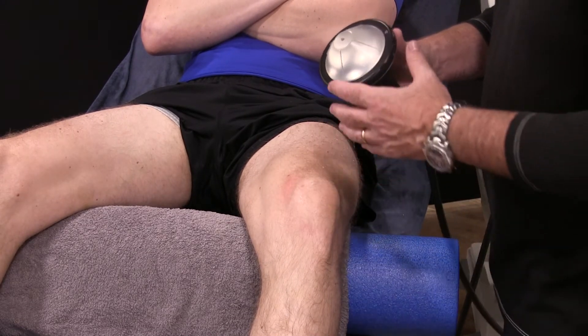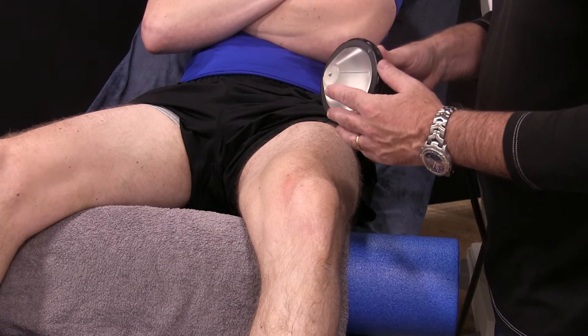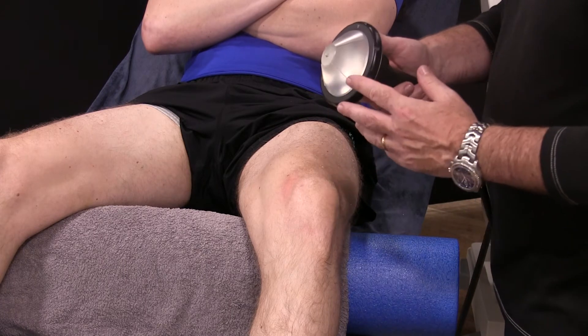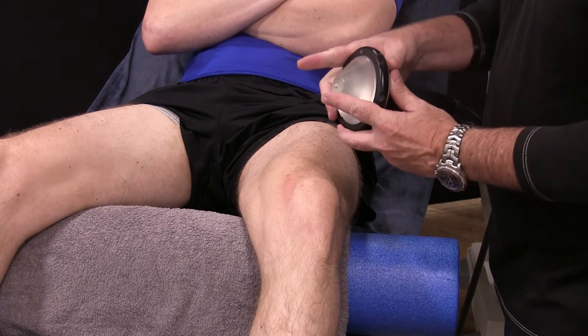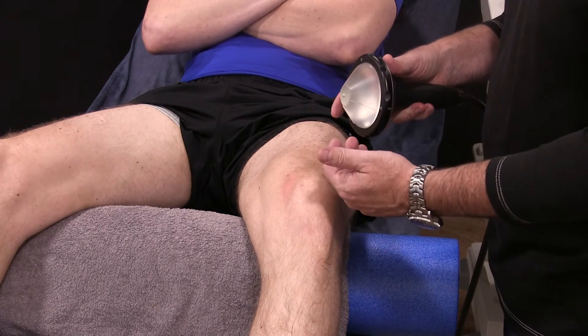We're here to talk about the Piezo Wave 2 from Elevation. The Piezo Wave is a focused shock wave — it uses an acoustic pressure wave, and those pressure waves are focused into an apex. That apex is then targeted at different tissues.